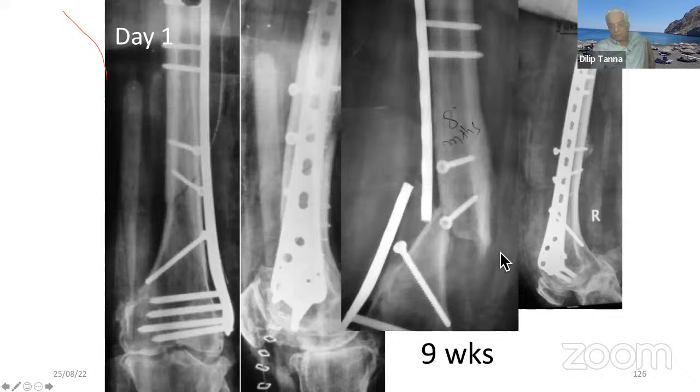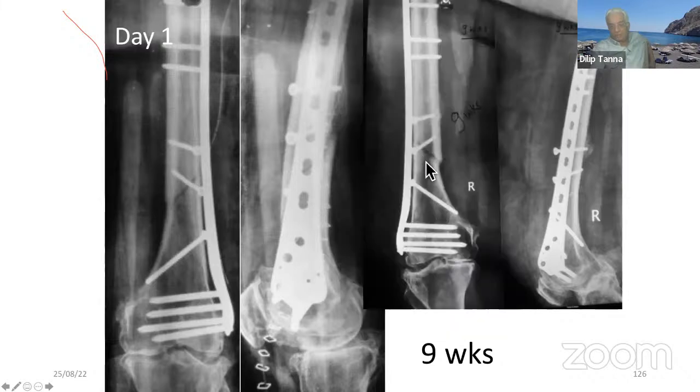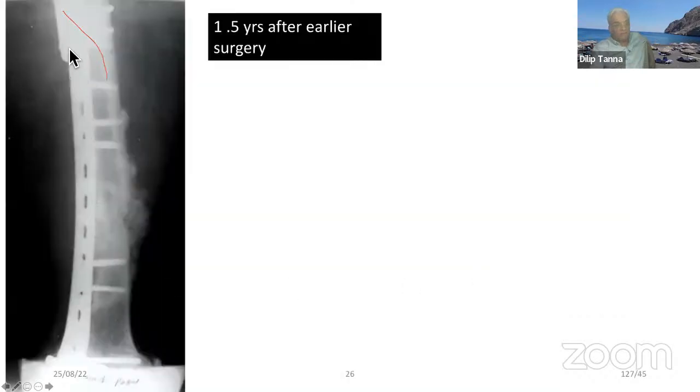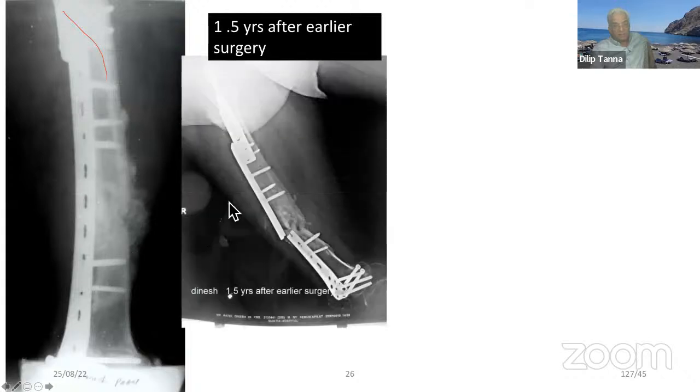This really broke down. And as you can see, it broke down at the same lag, which is not perfectly done. Now, the only way was a long plate, bone graft medially, and the thing would become all right. But this also broke down. Again, this is not a good treatment for this fracture.